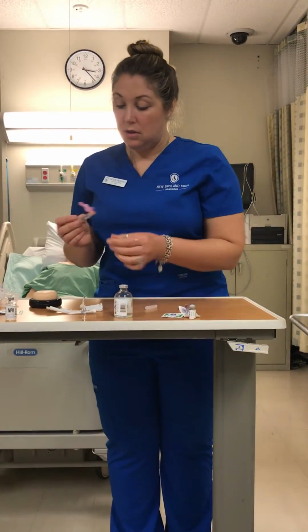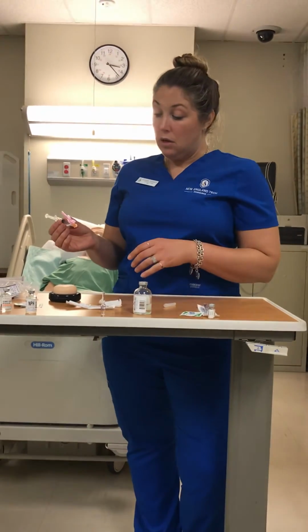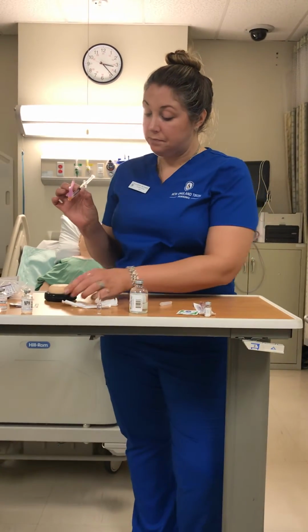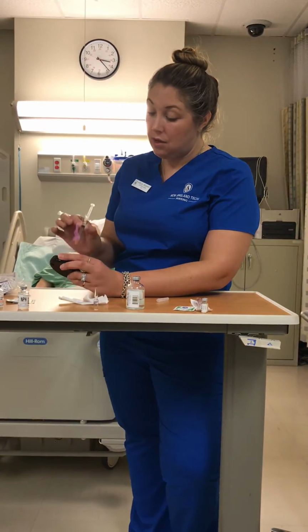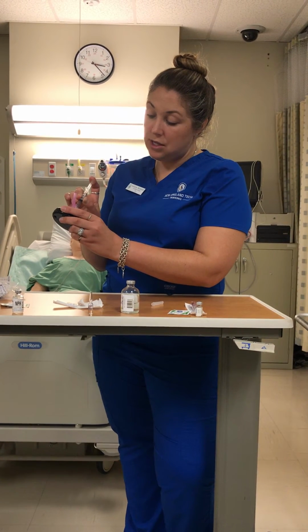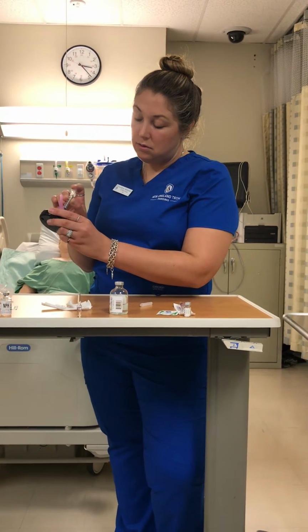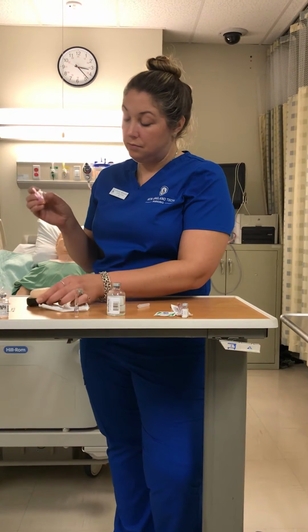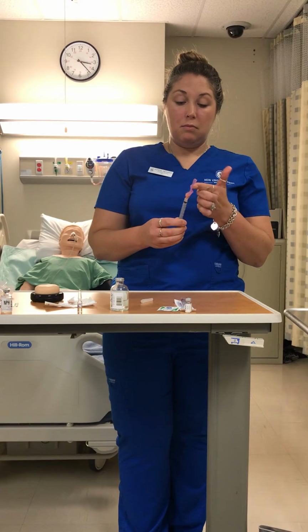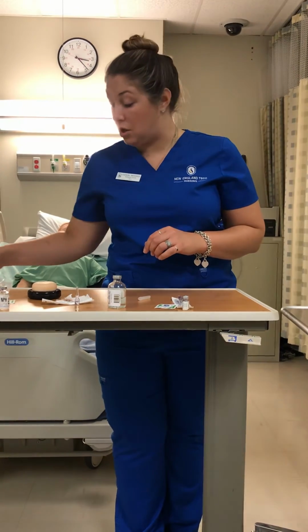And then with an intramuscular or subcutaneous, you also want to hold it like a dart at a 90-degree angle. Quickly administer the medication, and immediately pull out. Now this one has this special feature. You can flip it up and it automatically covers the needle. You throw the needle into the sharps container.